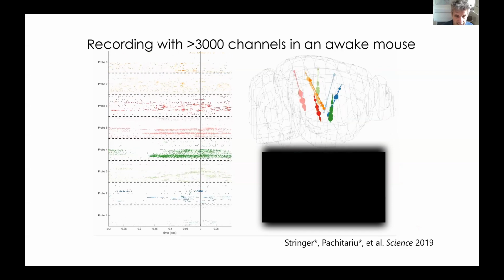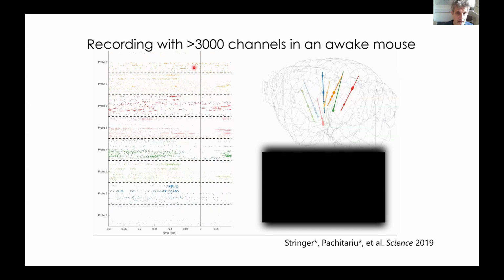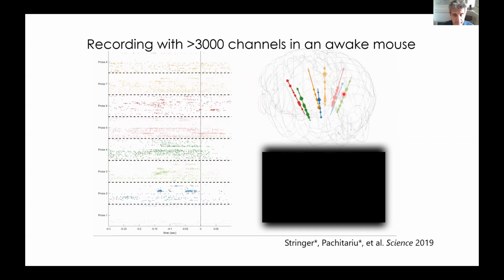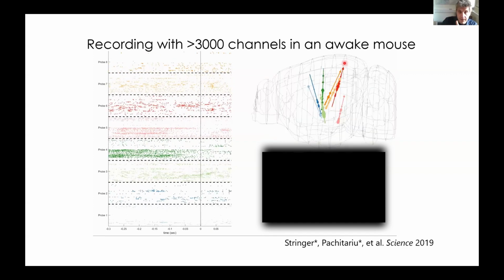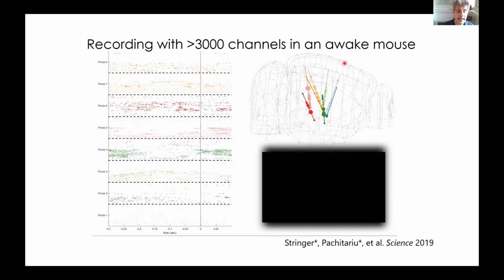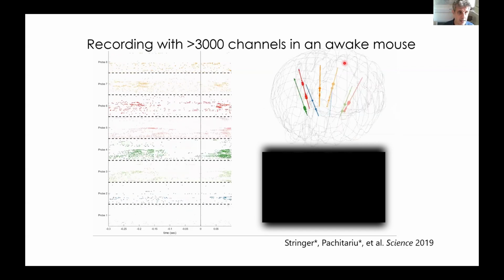This is actually a live video of that mouse. And here we see the moving rasters of 8 probes simultaneously recorded. And here you see the firing rate at different points of those probes. And you can see that these fluctuations of the synchronized state that we saw before in one region are really brain-wide. And understanding that structure is a totally open question.